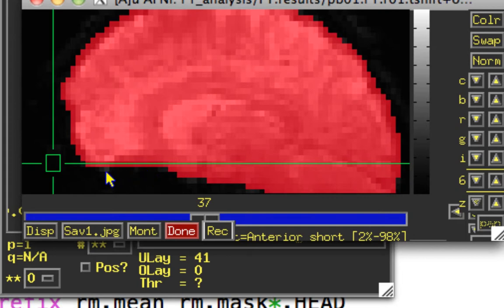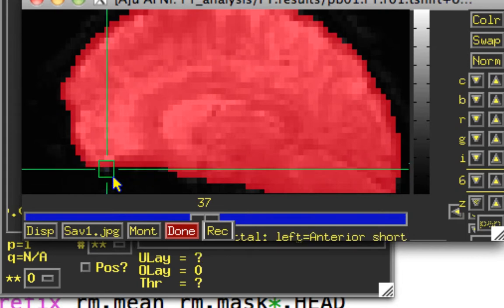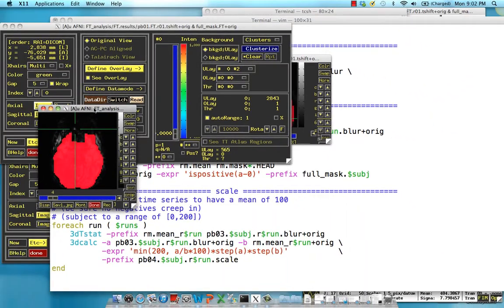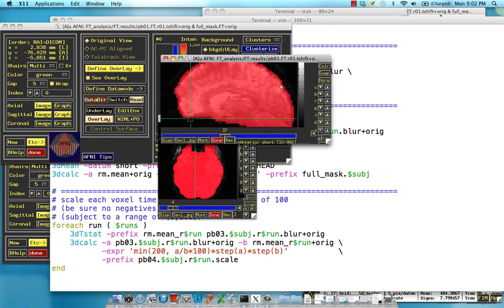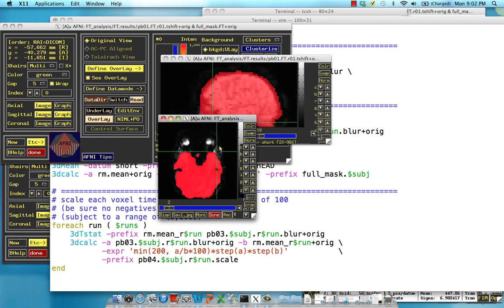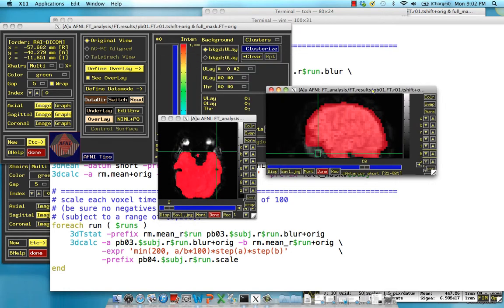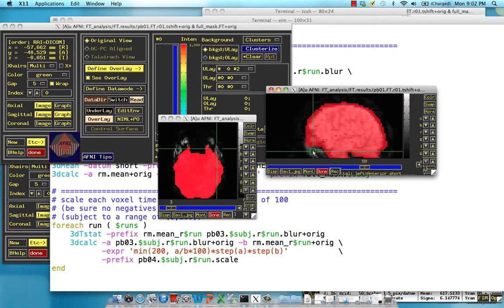So you can see, there seems to be one spot where there's actually some intensity, but the mask didn't cover it. That still seems to be okay. But more importantly, if you get down near the temporal lobes, there seems to be some signal dropout. And so 3D AutoMask thinks that it's really not brain. It seems to be non-brain. So it doesn't do a perfect job, but overall it does pretty well.